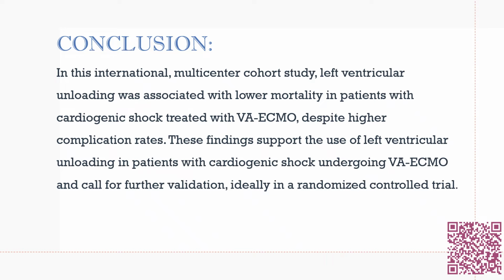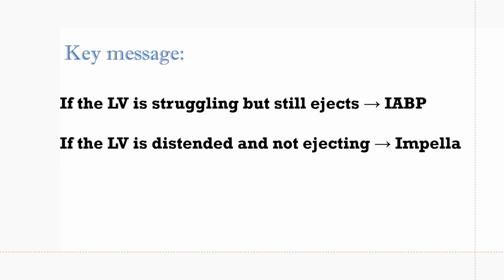These findings support the use of LV unloading in patients with cardiogenic shock undergoing VA ECMO, and need further validation, ideally with a randomized controlled trial.